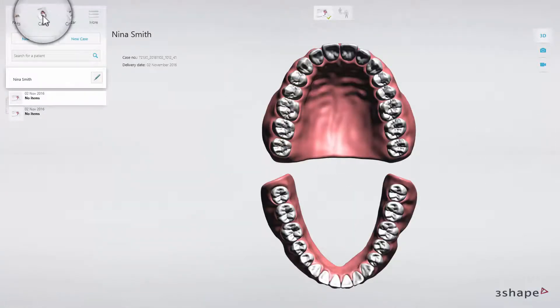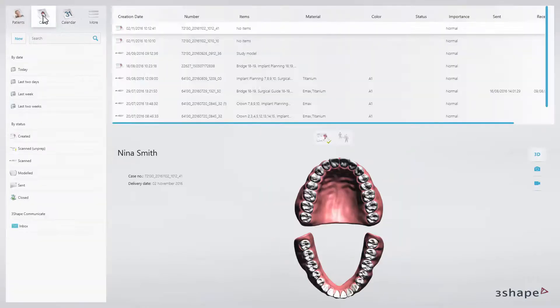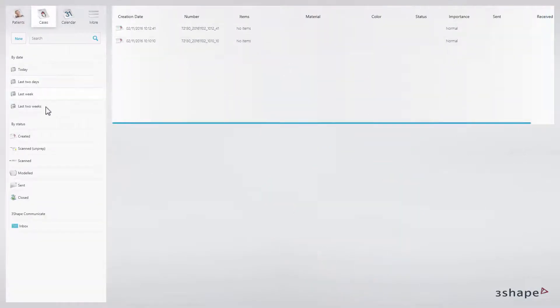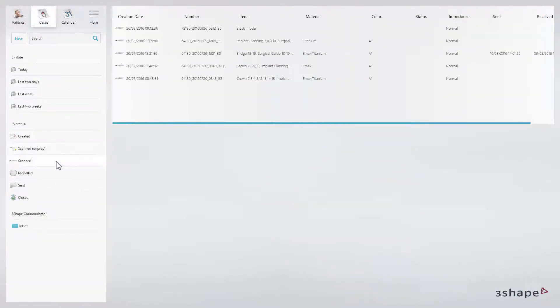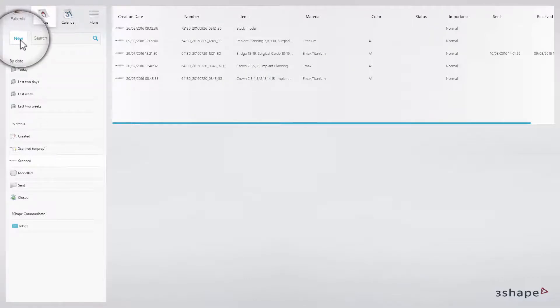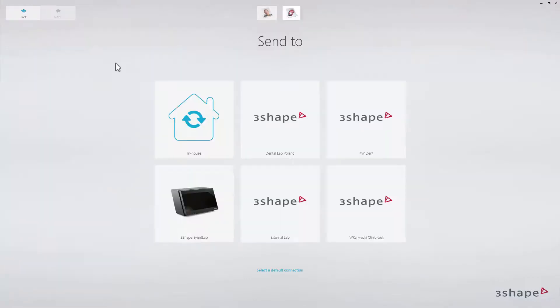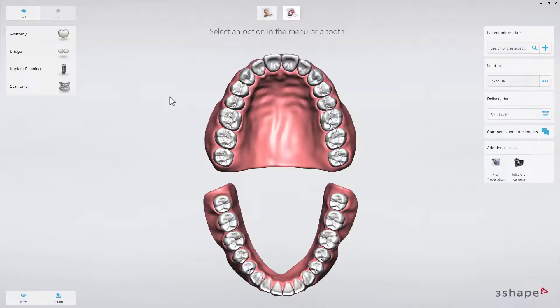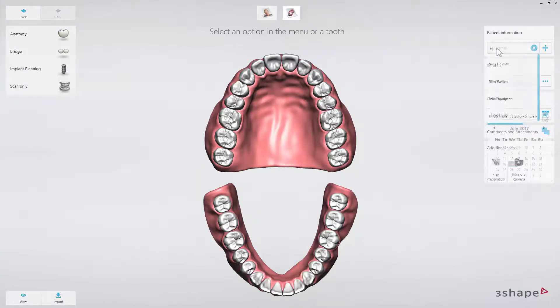On the cases page, you can sort your cases by date or by status. Creating new cases from this view can be done by clicking the New button. You will then choose the partner you wish to send the case to and fill in the rest of the details.